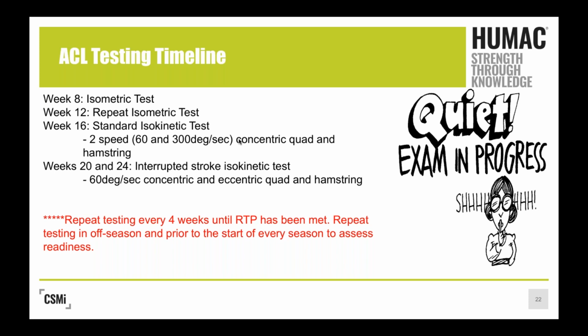I like to use it at week 16 just to get it more dynamic. Like John told us in episode 5, you can produce less force concentrically than you can isometrically. So you're going to get less torque produced, but having that knee moving while they're producing the force, I think it brings a little more dynamic into it. But I only use it then.